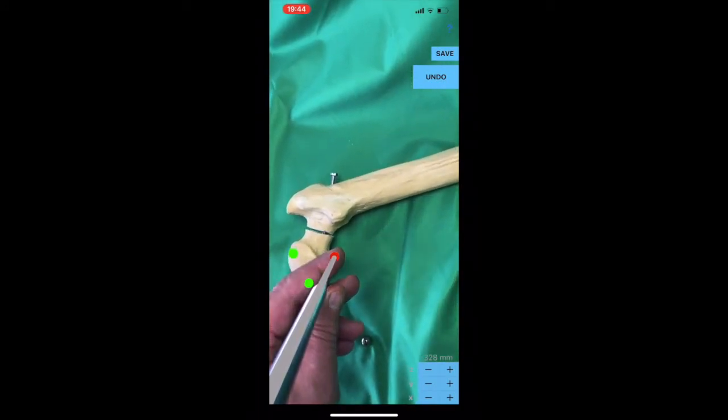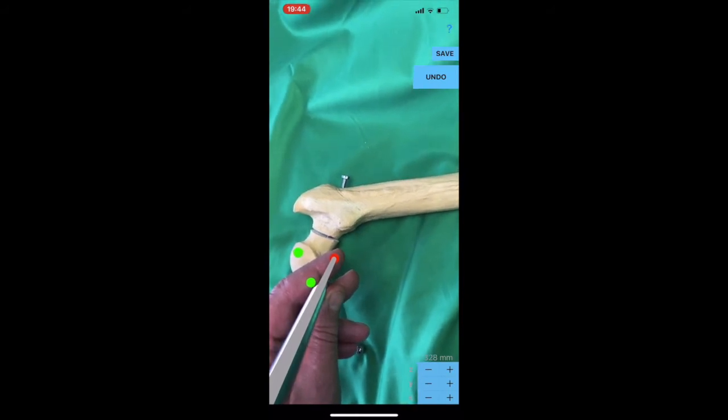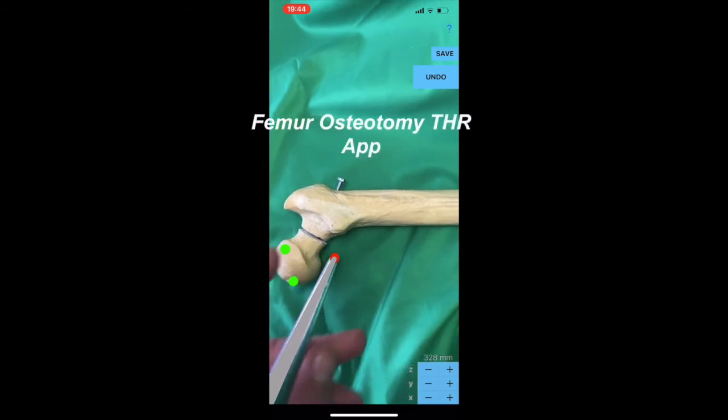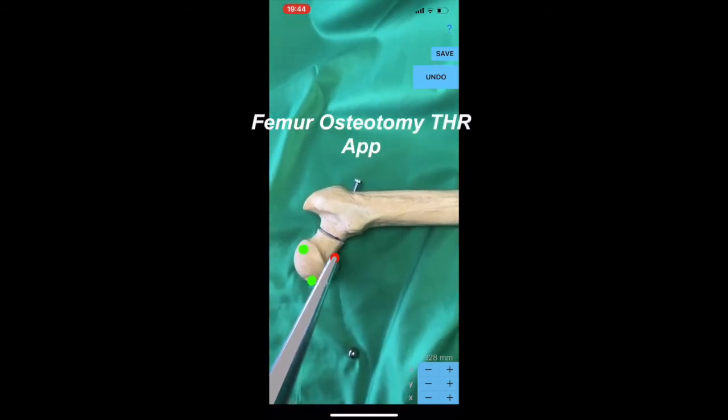Femoral registration. Following surgical exposure, and once the surgeon has approached the patient's femoral head, which is dislocated from the acetabulum, registration follows the above-mentioned technique. A. Registration of femoral head and femoral neck.